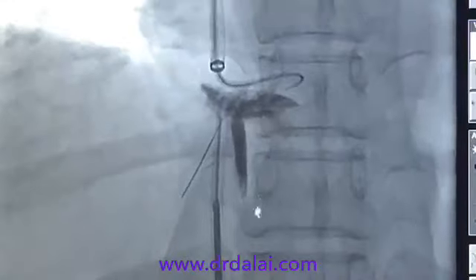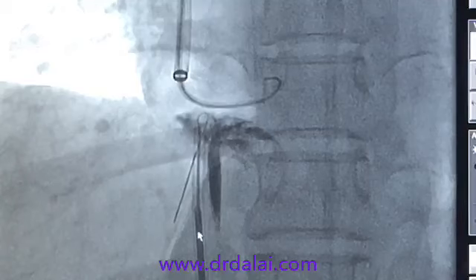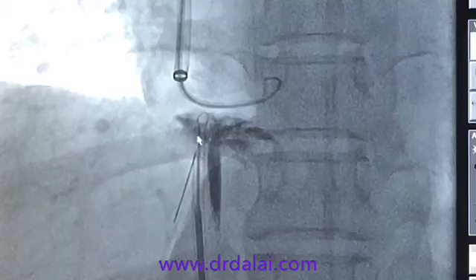This is what I'm trying to do. I have my angle sheath over here with a wire and the catheter so that it's well protected and not hurting the heart. And from here I have gone with the triad of the long sheath, the septal puncture needle, the Chiba needle and a 14 wire. So these are the four things that have gone: the sheath, the septal puncture, and the Chiba and the 14 wire all together.